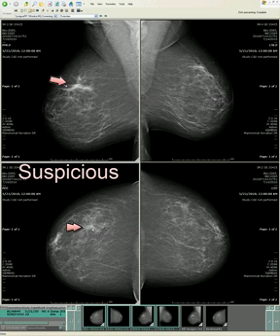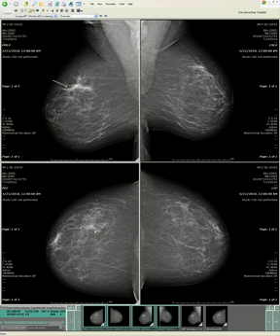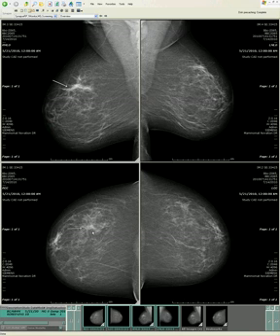There are only a very few things on the list of causes of this kind of appearance: cancer being number one, the radial scar being number two, and then previous surgery or some kind of injury being number three. That's it — it's a short list. So if you can eliminate any previous serious injury or surgery, then you are left with this being cancer until proven otherwise. Architectural distortion is very difficult to perceive, especially in a dense breast. Here we're lucky enough to see this in a background of fatty tissue, so it stands out more readily, but it's just as ominous, just as dangerous, if not more so than a super suspicious mass or calcifications.